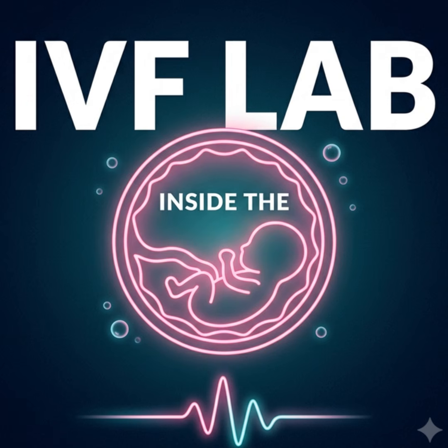So what does this all mean when we put the pieces together? When we step back from the AI algorithms, the near-infrared cameras, and the minute-by-minute timestamps, we see that time-lapse imaging changes not just what the laboratory sees, but how the laboratory fundamentally interacts with the very fragile beginning of life. It moves us from being disruptive, intermittent observers to constant, quiet witnesses.